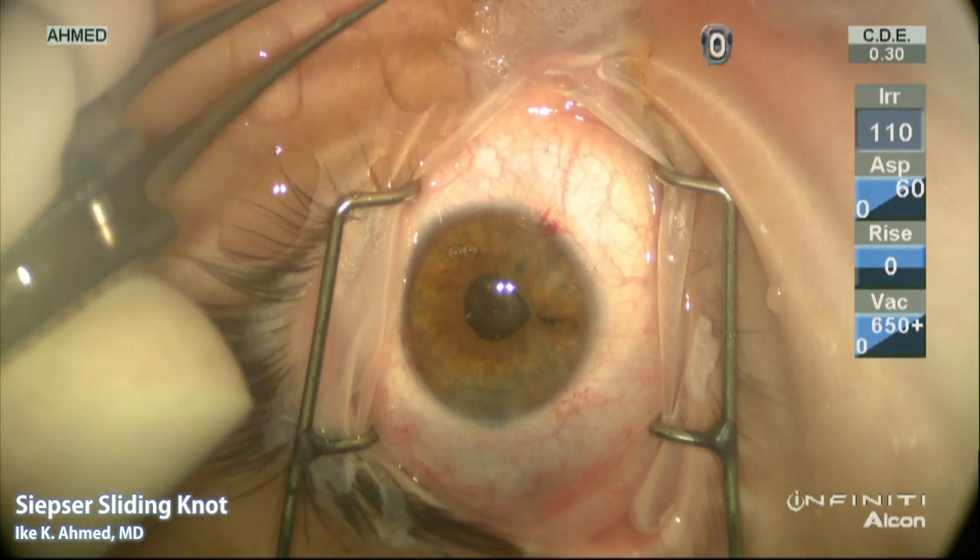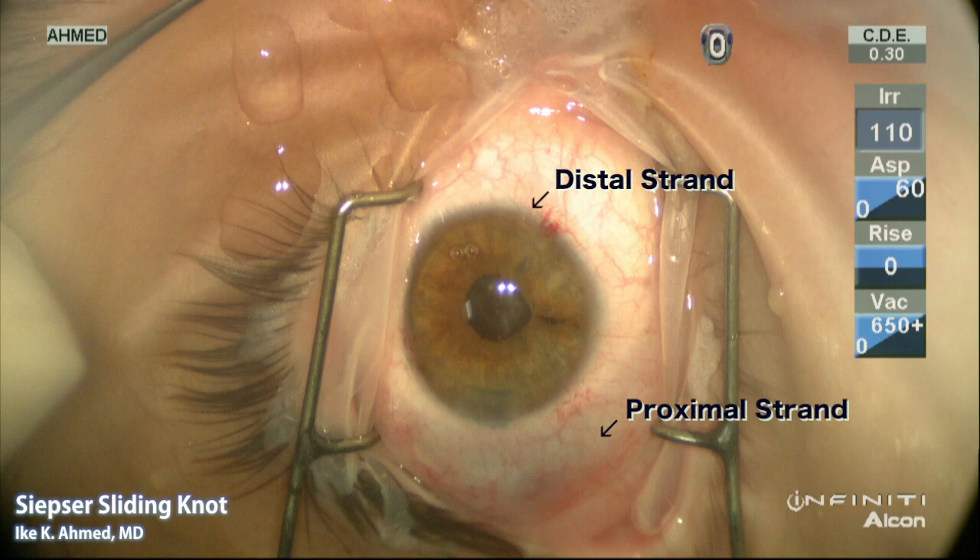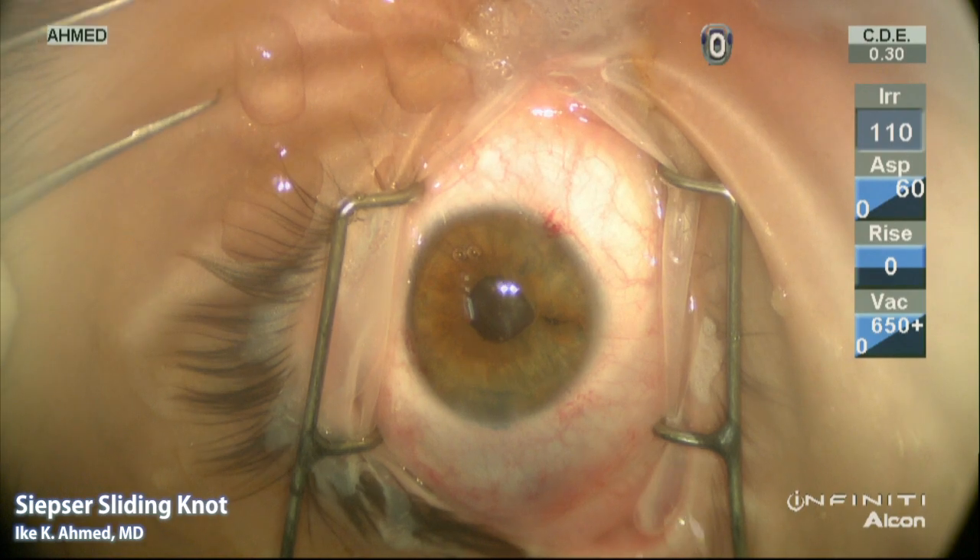At this point one will note a proximal strand here in the bottom of the screen as the surgeon's view shows, and a distal strand which is visible on the superior aspect of the screen, or the nasal side from the surgeon's perspective. It's important to differentiate the proximal from the distal strand as we'll show in the next few steps.